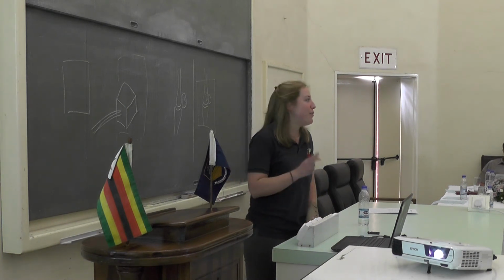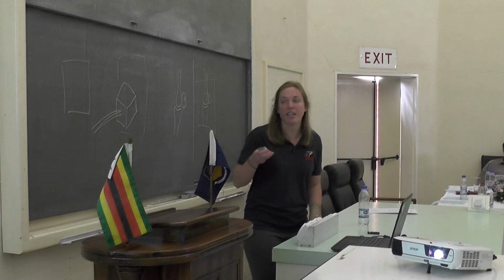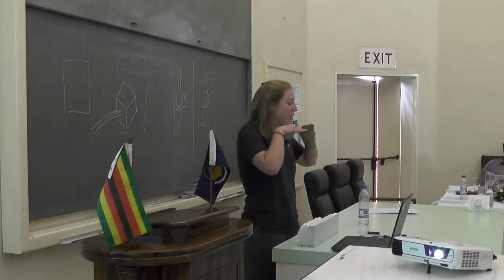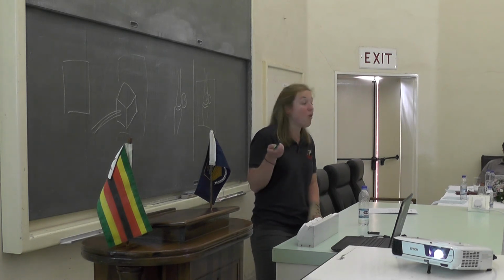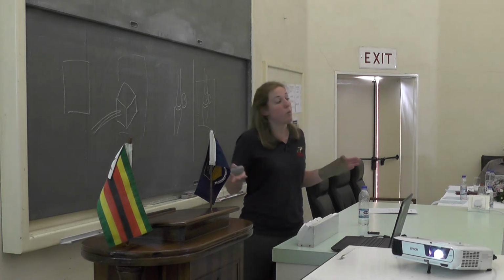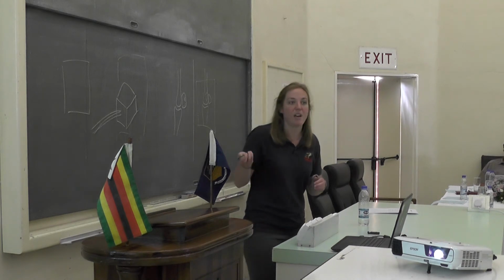And then, just to finish up before you all completely go to sleep, think about your patient, think about your anatomy. Like I said, you want to cut your structure. If you're looking at a joint, you want the rays to penetrate through that joint as much as possible without any superimposition. And that changes according to the anatomy of the animal. Very evidently, it changes, for example, between horses and donkeys. If you look here, how different is this? If you take the exact same landmarks of centering 1 centimeter below the coronary band, it might not work for that patient, because this donkey has a lot more hoof than this horse here, and than many other horses, for example.